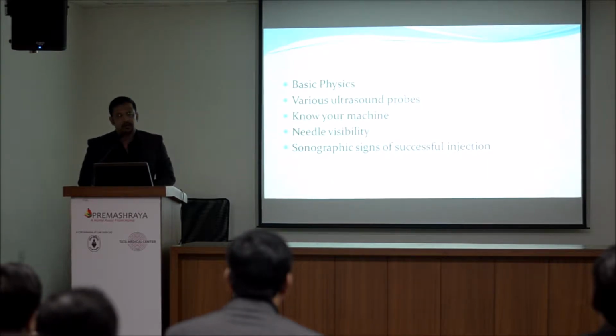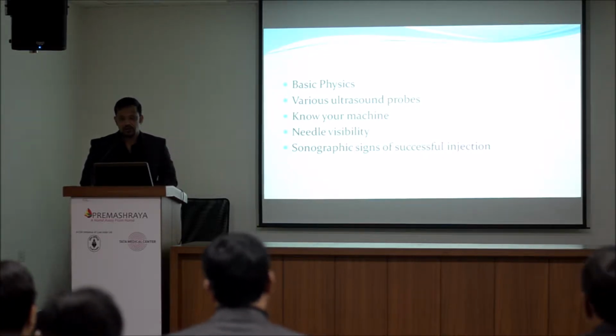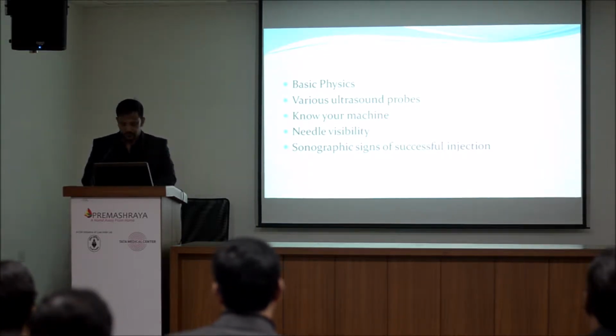Just really covering the basic physics, various ultrasound probes, the machine, how to visualize the needle, and what are the signs of sonography, signs of successful injection.